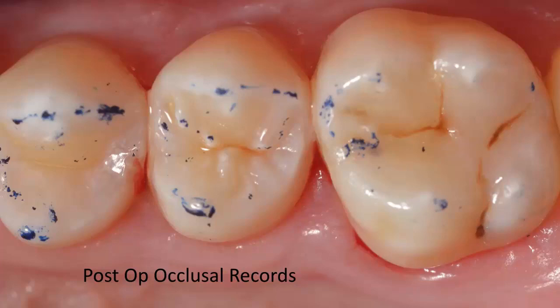Any spot is not a high spot. You can see a lot of marks in the pic, but these are not the high spots. A high spot is basically a bull's eye mark that seems to be shiny in the middle, and from the periphery it's well colored by the type of articulating paper we are using. So every spot is not a high spot. To check your high spot, you are supposed to check your articulating paper once you occlude the patient's teeth. The articulating paper should have been pierced from the center, and you can see a shining spot on the patient's teeth.